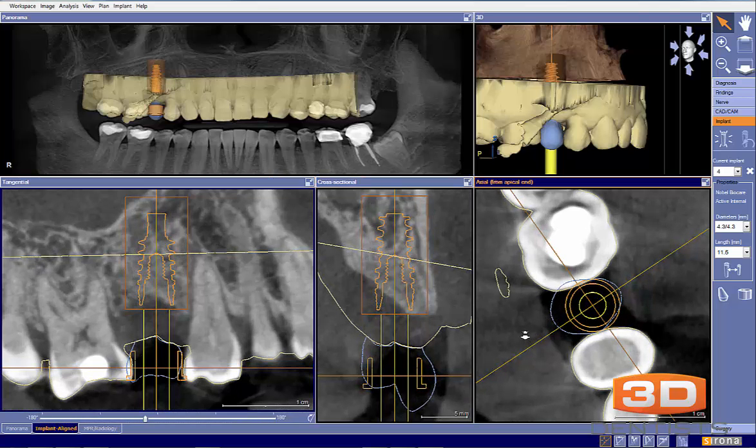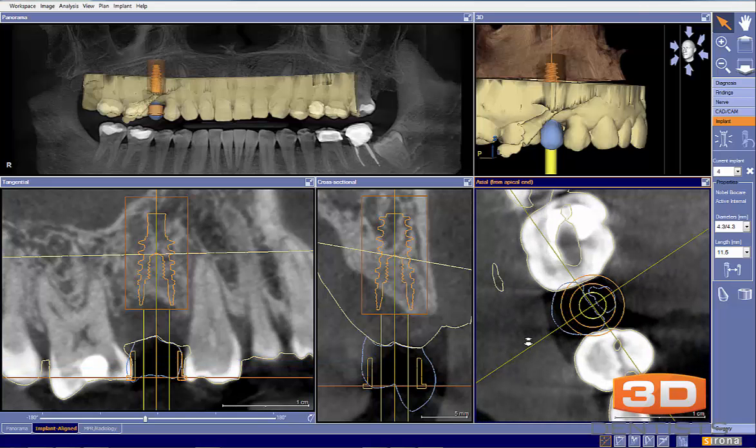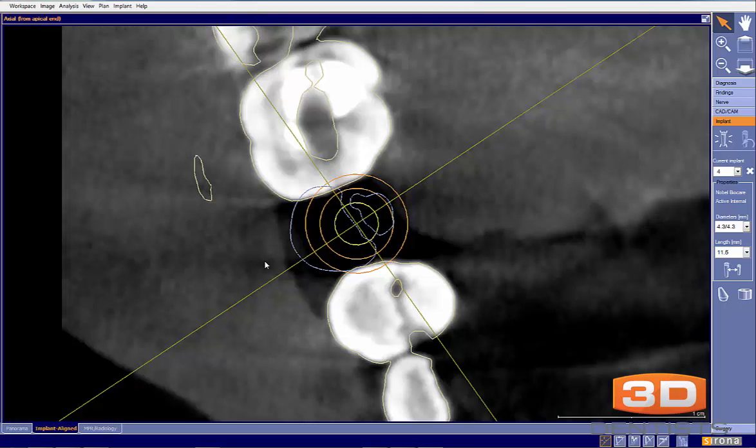Now sometimes people will say to me, well, I could just adjust the adjacent teeth, and certainly that's an option, but what I see here is we'd have to adjust the adjacent teeth quite a bit to make that fit. So right there is our tooth, and this is how much of that ring goes in.